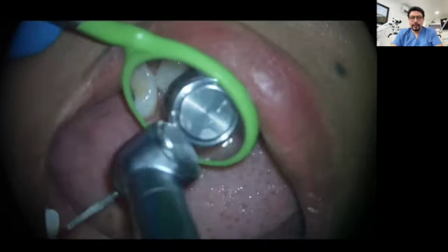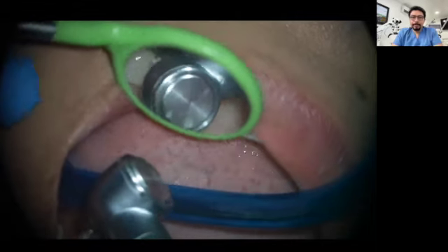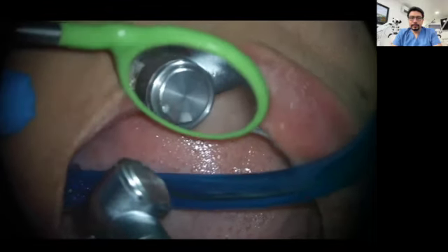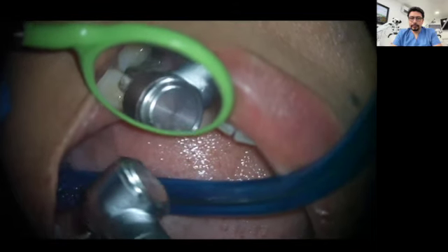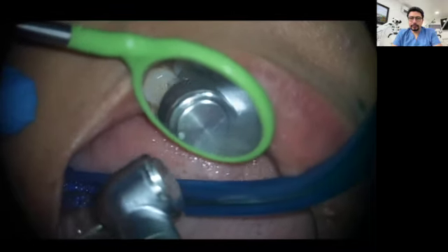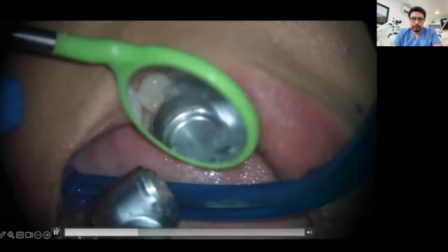One of the basic principles when working with mirrors and the microscope is to place the mirror as far as possible from the working area. If you are working in the upper arch, the lower lip will be your guidance for the placing of the mirror. Ask the patient to open as big as possible and use the lower lip as the point of reference. If you follow this basic principle, you will be able to position the mirror in different angles, and you will avoid getting the mirror full of water drops that will interfere with your vision.